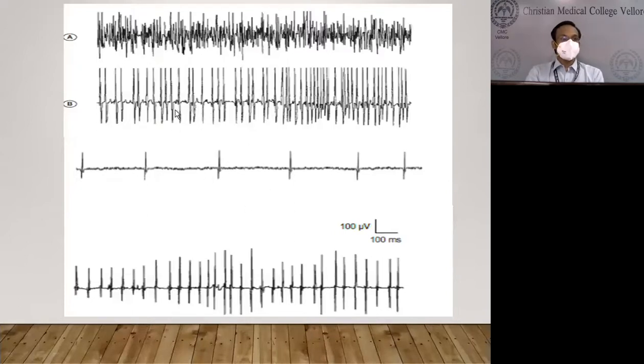While in this, when the patient is fully activating, there is a number for the frequency and the number of motor units. So this is at 30 hertz, only 1 motor unit is seen. I forgot to put that legend. So this is definitely a reduced recruitment that is seen in this.